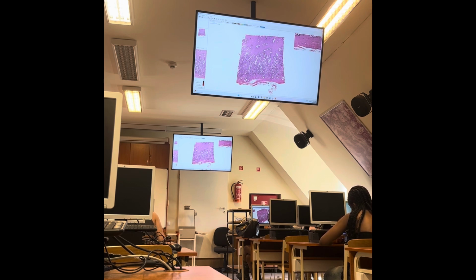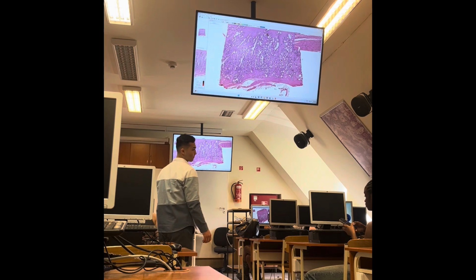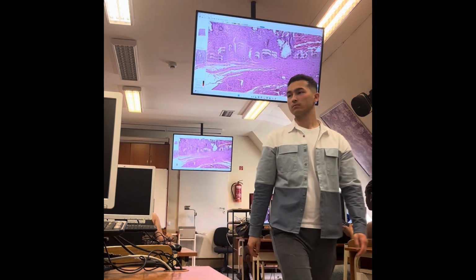the layers, but as we see the connective tissue capsule, we can say that most probably these glands, what you see here in high density, these belong to the main glands of the prostate. Okay, so these are the parts. Main glands of the prostate are the sites where typically cancers of the prostate appear. So this is the peripheral layer. Now let's see more of the details.